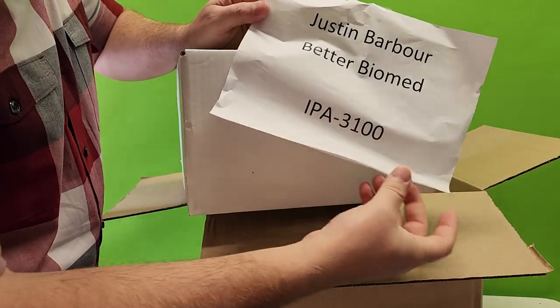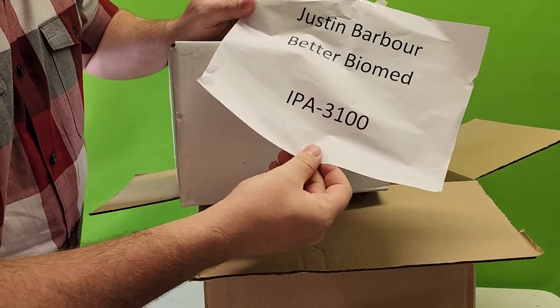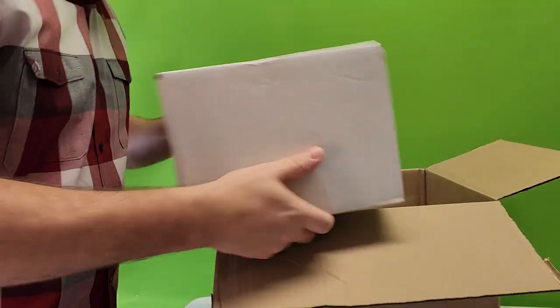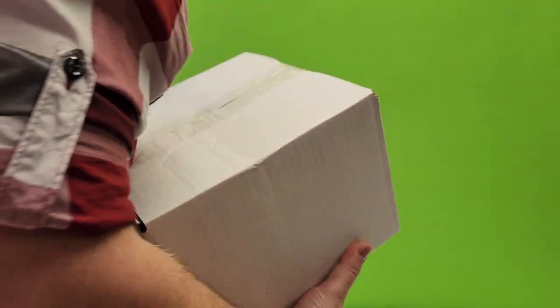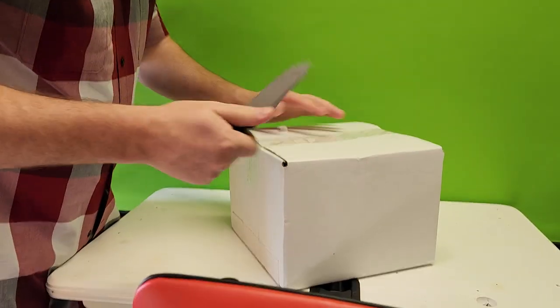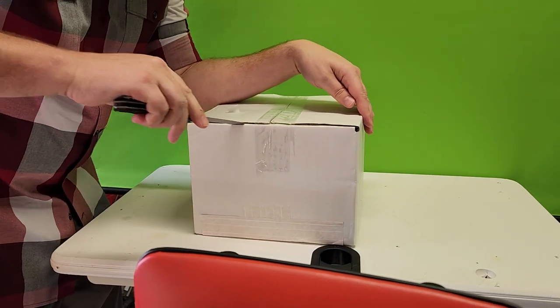It says Justin Barber, Better Biomed, IPA 3100. If you guys don't know what an IPA 3100 is, we're going to find out together - brothers and sisters, we are about to find out together.